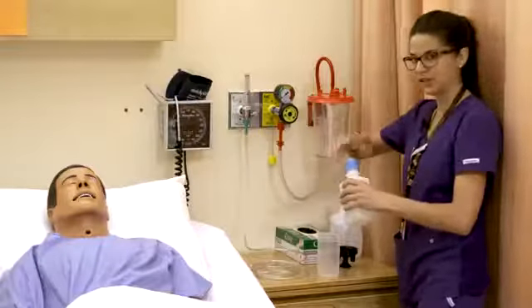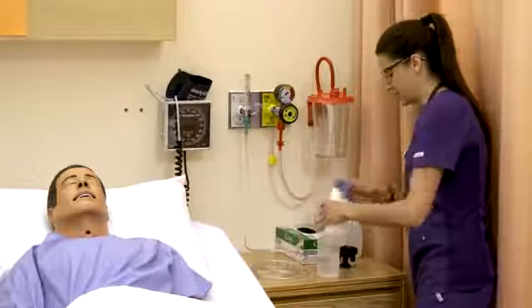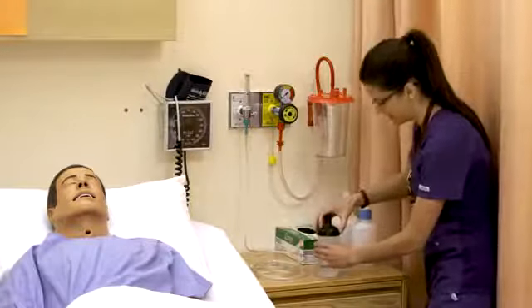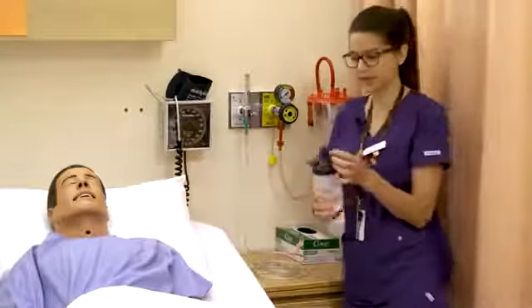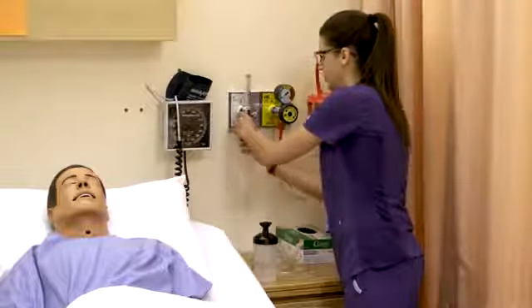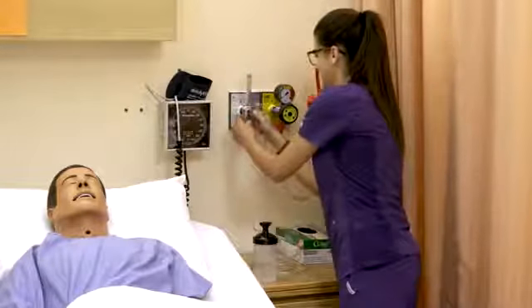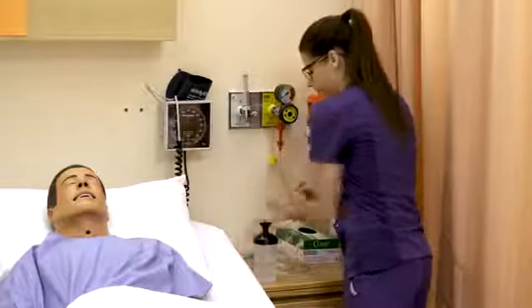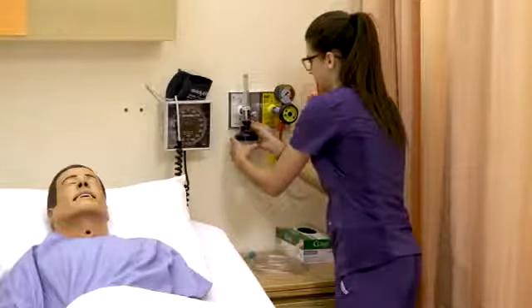So you'd want this to be a new bottle that you crack open. And there's a max fill line and a min fill line. So you want to make sure you're within those parameters, and then you just put your cap back on here. And this actually has its own adapter piece. So you can't attach it to the Christmas tree adapter. You actually remove that. Oh, and I put it on nice and tight there. So you'd want to remove your Christmas tree adapter and attach your humidifying bottle.